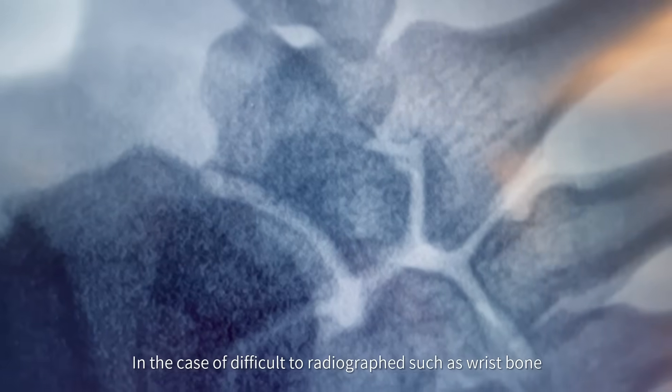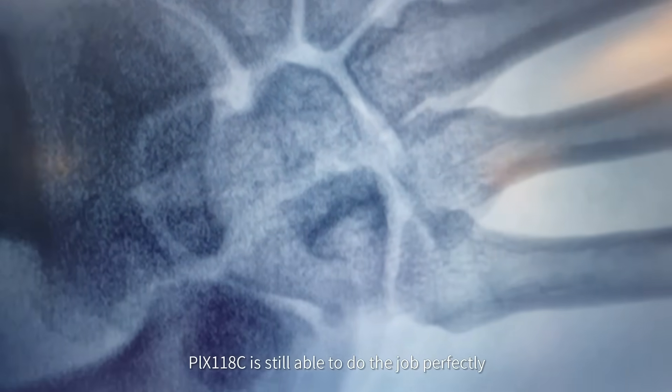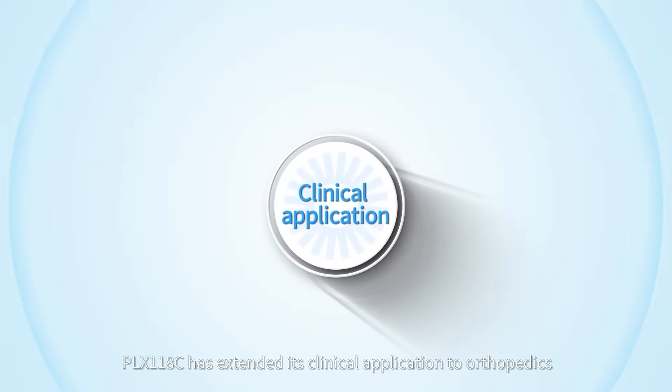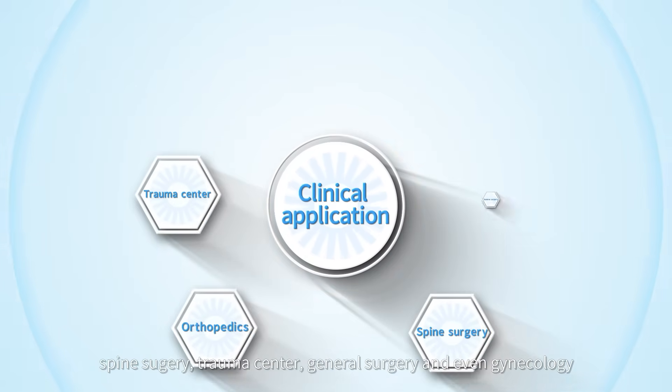In the case of difficult radiographs such as wrist bone, the PLX118C is still able to do the job perfectly. With these features, the PLX118C has extended its clinical applications to orthopedics, spine surgery, trauma center, general surgery, and gynecology.